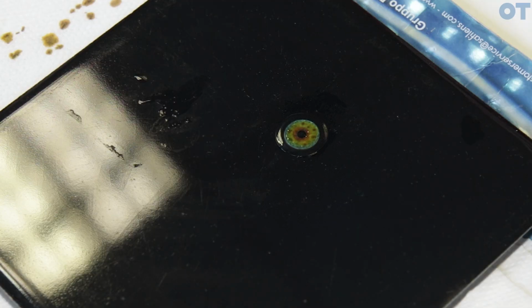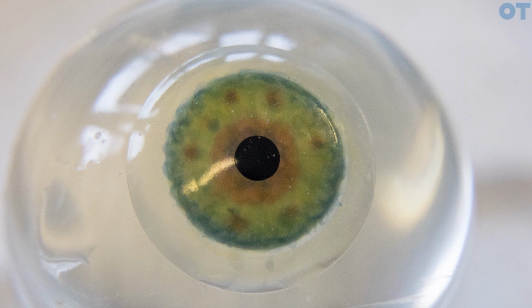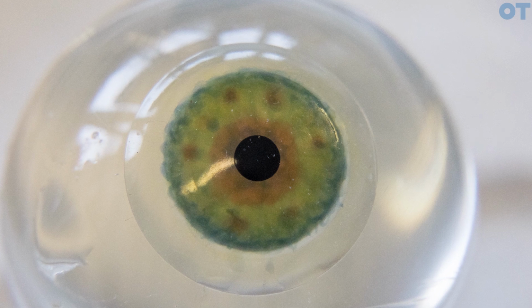So every now and then you get something a little bit different. I mean, the key thing is just to blend everything and keep everything quite soft looking and quite natural looking. That's the key thing when painting them, really. So yeah, I think that's pretty much as far as I want to go with that one for now.